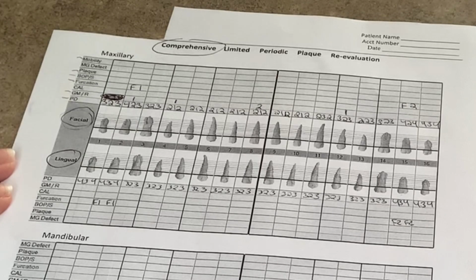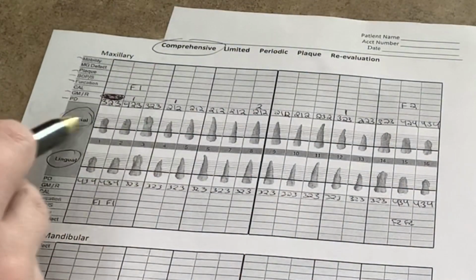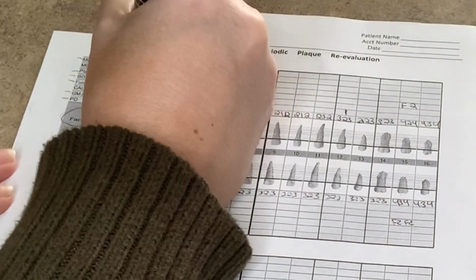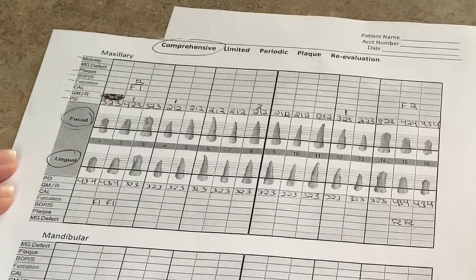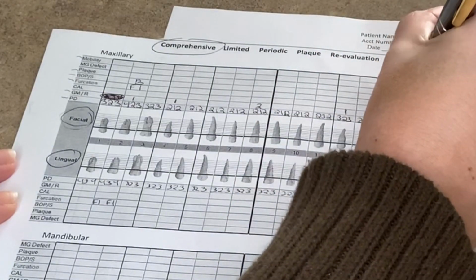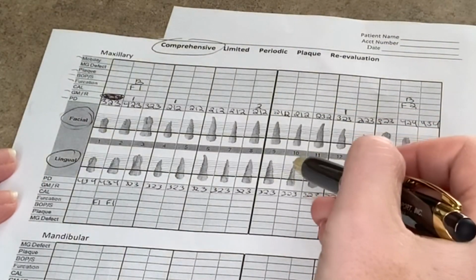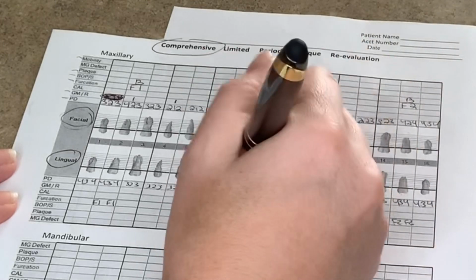Okay, so this is the blood or bleeding points. So the hygienist will say, like, the direct facial of number 2 is bleeding, or on the facial for mesial, or I put there the direct facial of 15 is bleeding.